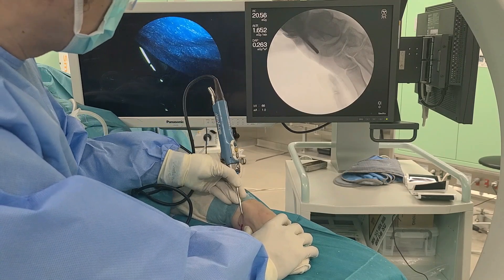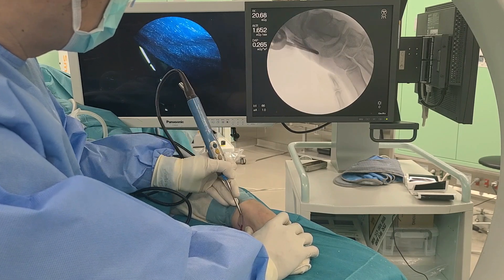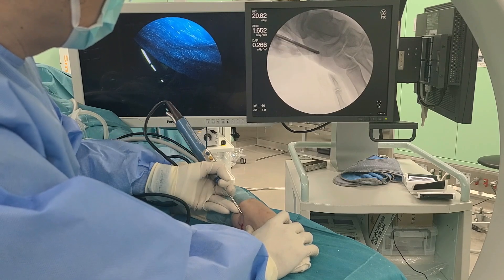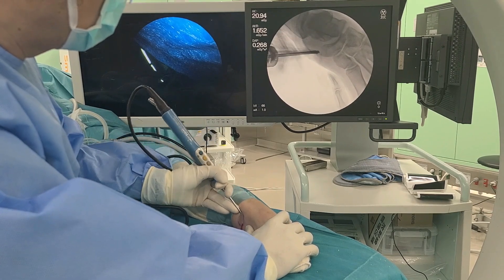After resecting the accessory navicular, the prominence of the navicular remains palpable. With the sole of the foot on the table, the abrasion burr is introduced through the proximal portal, and the navicular prominence is resected under fluoroscopic guidance until it is no longer palpable.